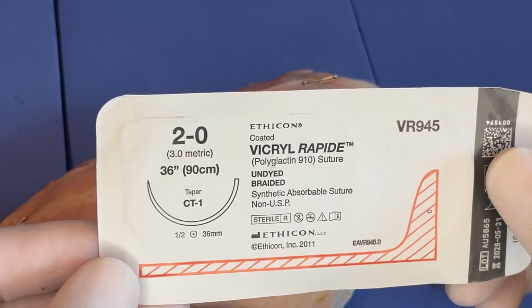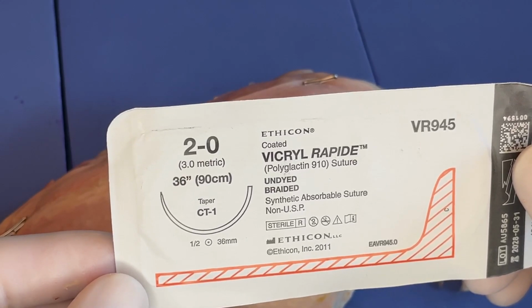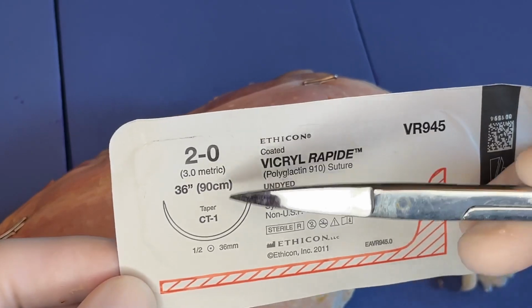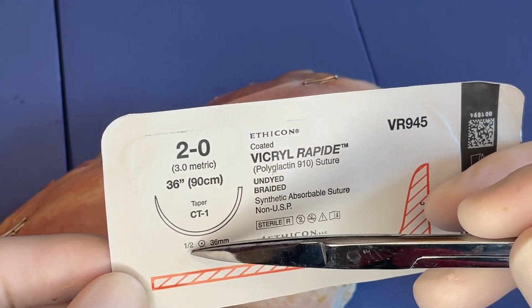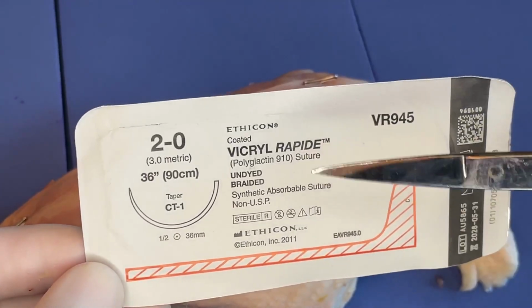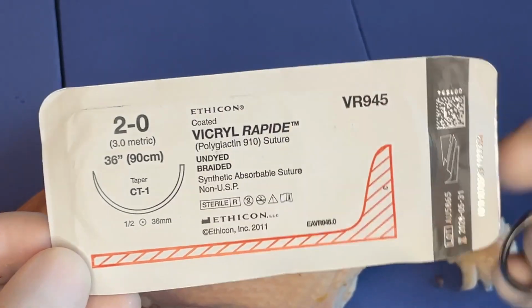When we open this up, we'll take a look at the anatomy of a needle. That'll be covered in the PowerPoint slides. You can see here that we've got a 90 centimeter length, a CT1 type of needle. It's a tapered point, a half circle needle. The Vicryl Rapide is undyed, so it probably won't have that characteristic purple color that most Vicryl or polyglactin has.